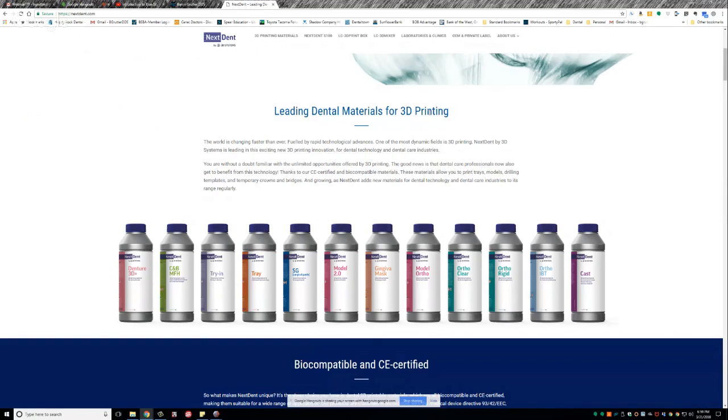At a couple of the meetings, the midwinter and whatnot, they sold so many printers and so much resin that they got a few more orders than they expected. So I'm sure they'll get caught up soon. But yeah, I know that Blue Sky Bio carries it, and then also you can get it through Patterson.